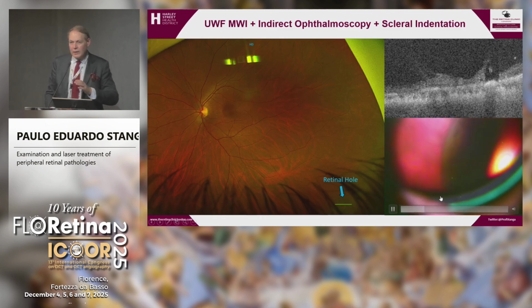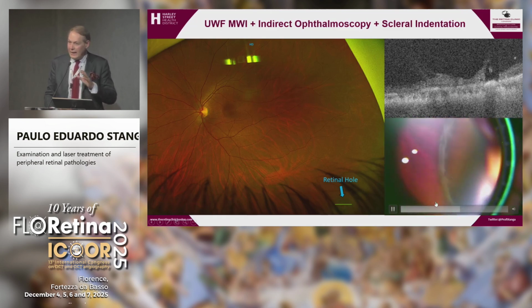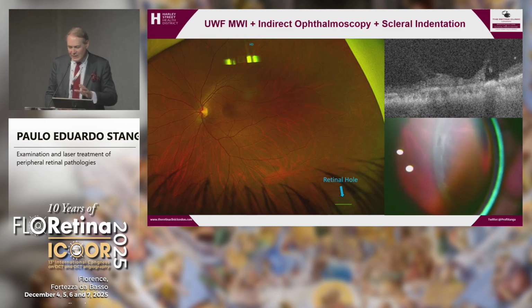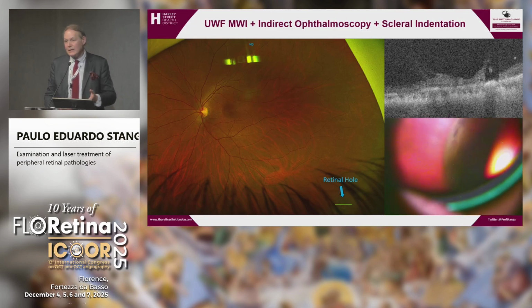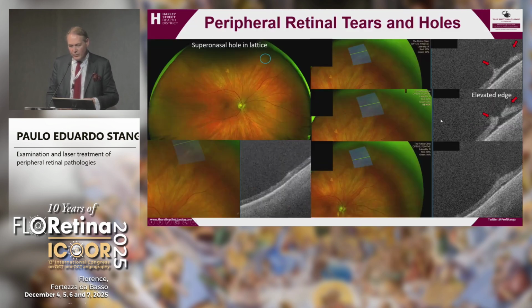Don't get me wrong, I cannot imagine my clinic without all of this imaging technology, but I also cannot imagine my clinic without indirect ophthalmoscopy. This is essential. You can see the hole there. And look how easy it is. That's not edited, okay? So very straightforward.